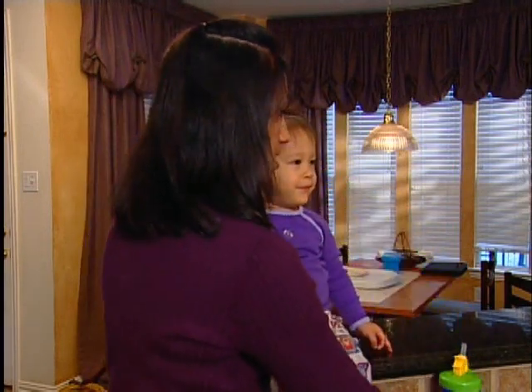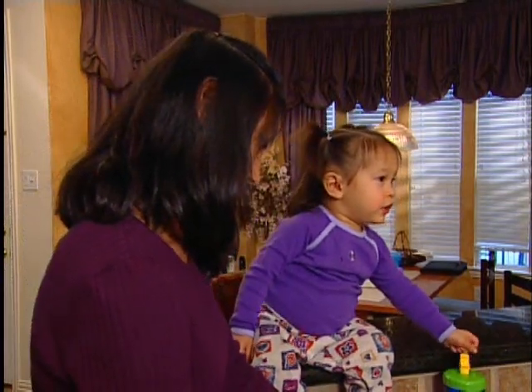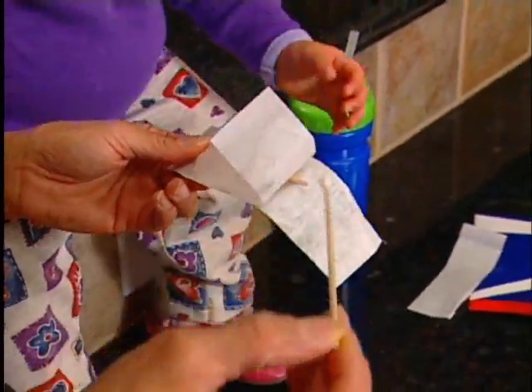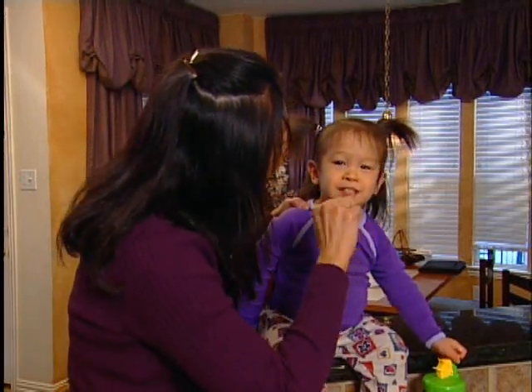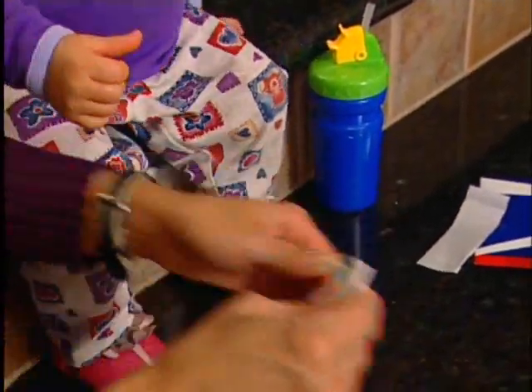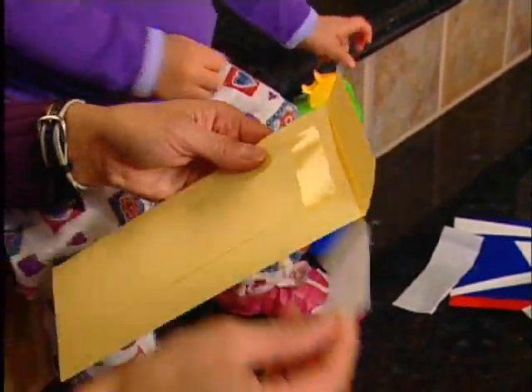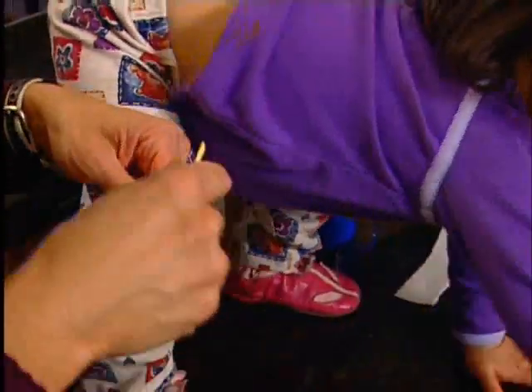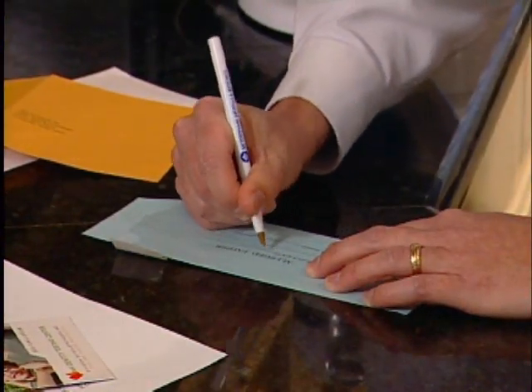Please make sure that babies' mouths are free of milk or formula at the time of sample collection, as milk and formula will contaminate the sample and result in the need for recollection. Feeding a bottle of water or wiping out the baby's mouth prior to collection will help get a clean, accurate sample. As samples are collected, place them back into the original packaging and seal into the appropriate color-coded envelope.